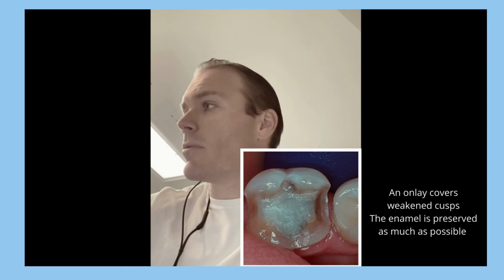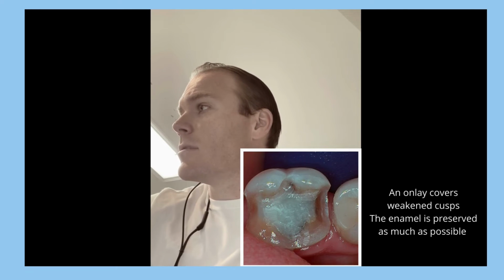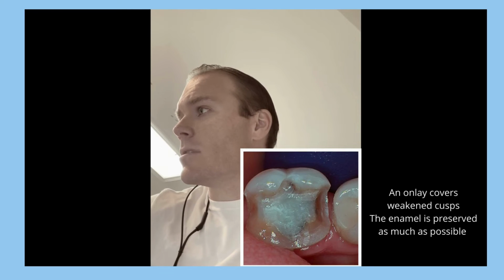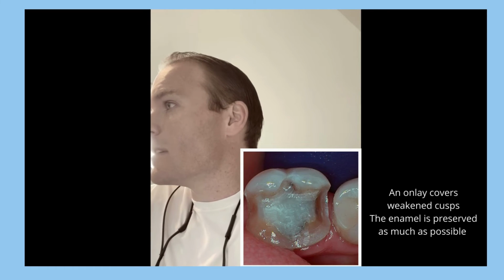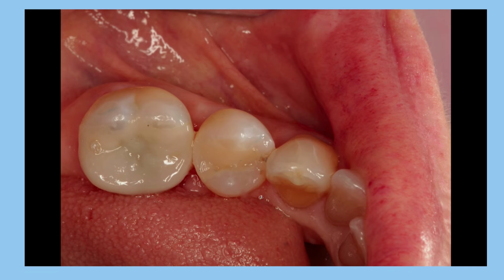But with this tooth, we ended up removing a cavity that was in it, removing and chasing the cracks. And the final preparation is an onlay style, which is a lot more conservative than a crown. You could have potentially done an inlay for a situation like this. It wasn't a huge metal filling, but we did an onlay, and then you can see here the final result.